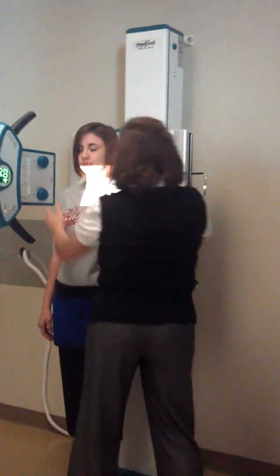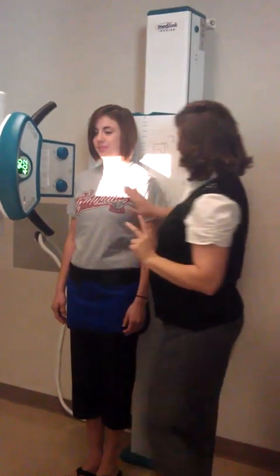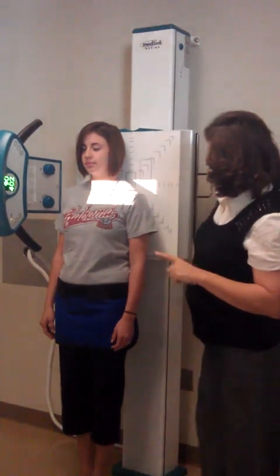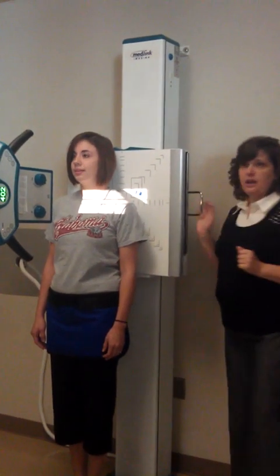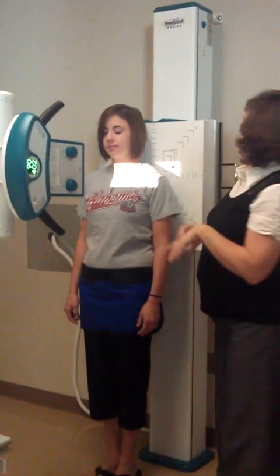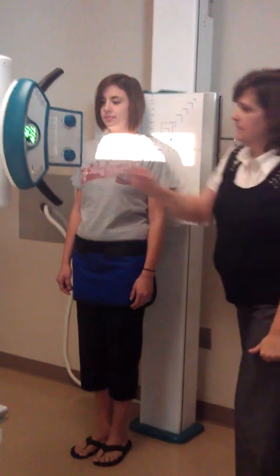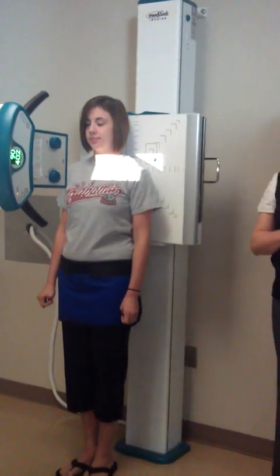I've got to drop it just a little bit. Now let her clavicle up here — we've got our ends, both ends that we need. You can see the light on the cassette. I use these double lines, and sometimes you have to make a note of the double lines, or you can call the marker out — just make sure you call the marker back to the original cassette. So this is our AP clavicle. Any questions?